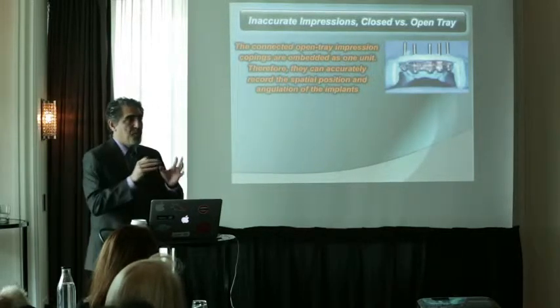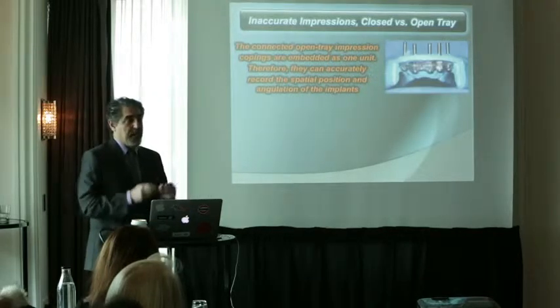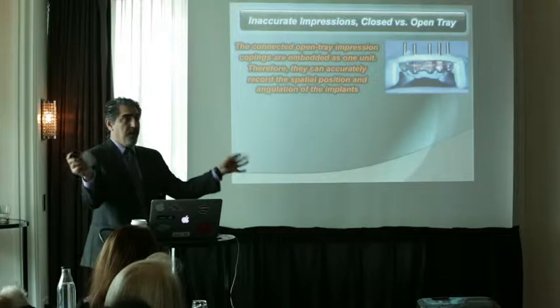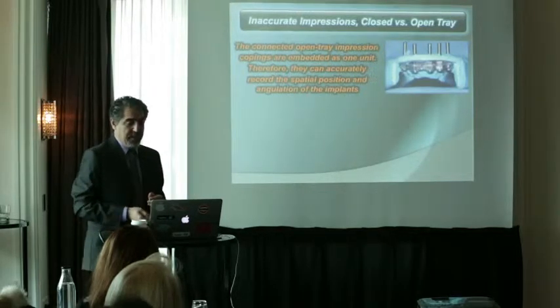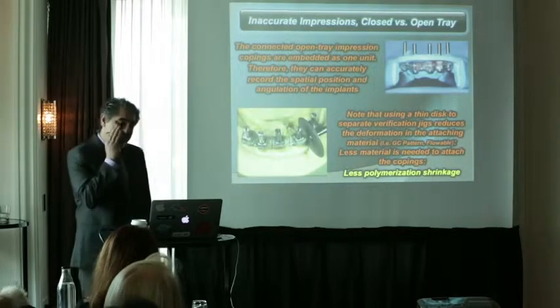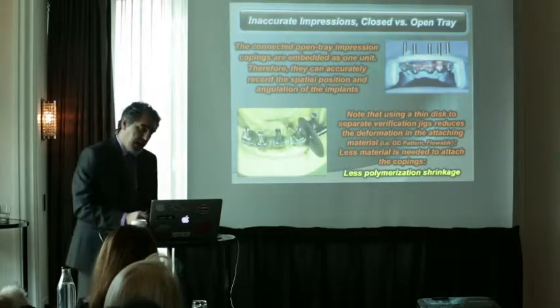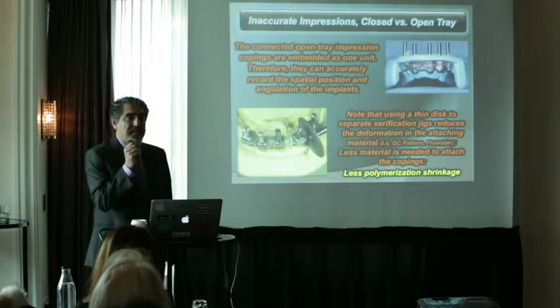So that doesn't do any harm to your impression. That's a very good way to do that, and you attach the copings to each other, and you can easily take good impressions. And the best thing about separating the verification jig is that now you're going to have a little material.